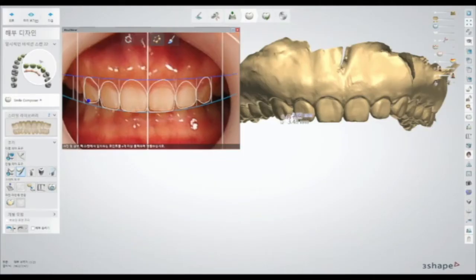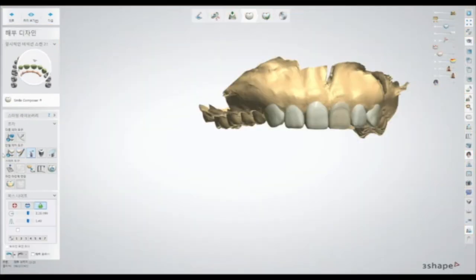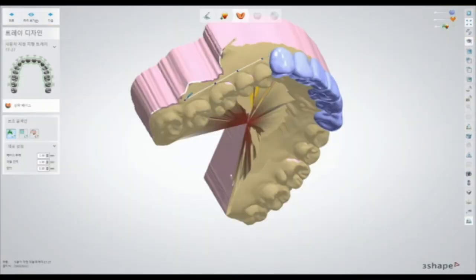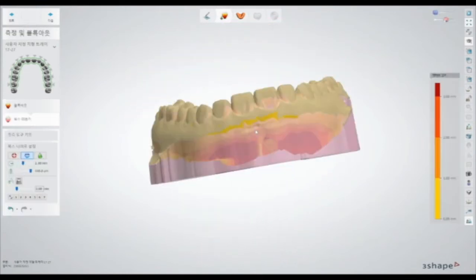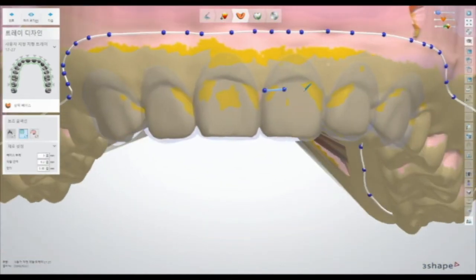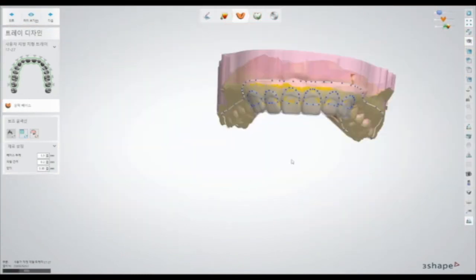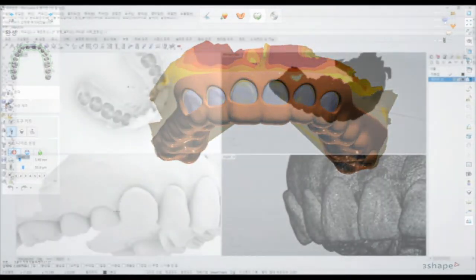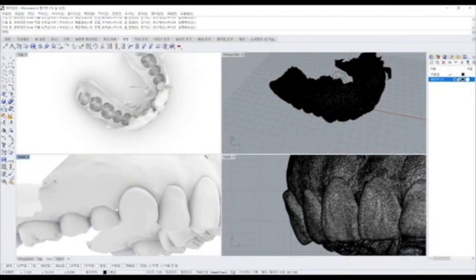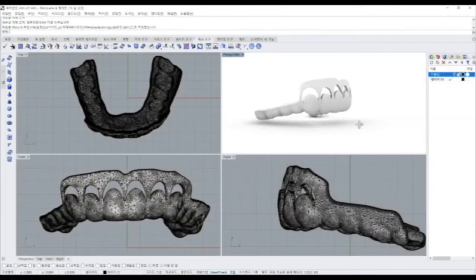Sometimes, the treatment for aesthetic enhancements is really demanding, because the patient's expectation doesn't meet the outcome done by manual. If you and your patient don't have perfect agreement, in this case, by using 3D printed template for mucogingival surgery, you and your patient can be on the same page by trying the template in the patient's mouth.